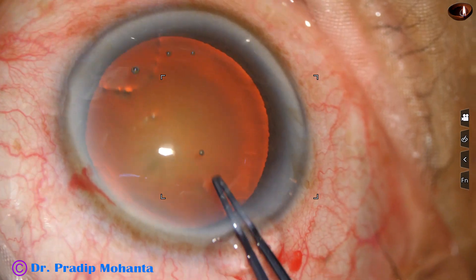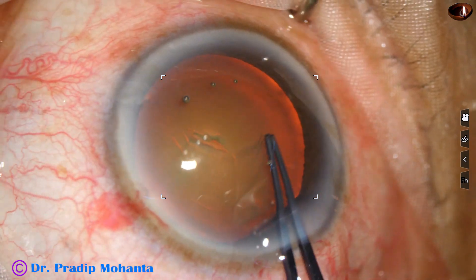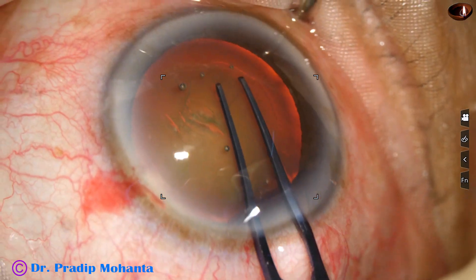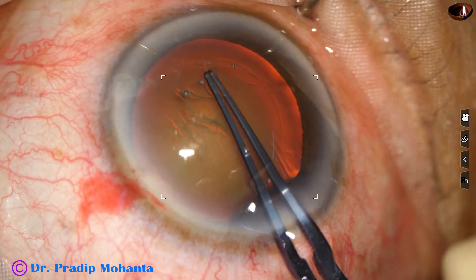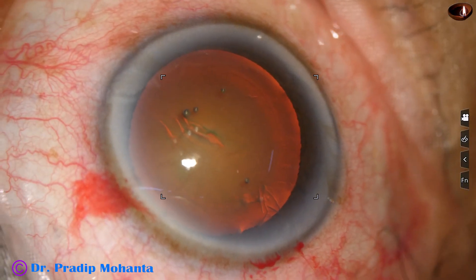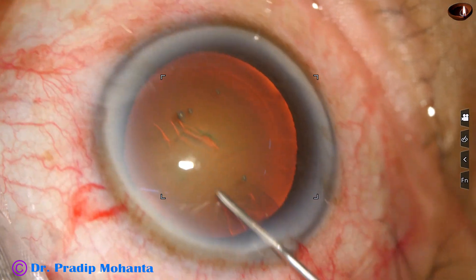Capsulorhexis is being done with the help of utratta forceps. There is a capsular tag. The tag is guided anticlockwise all around and an optimum size capsulorhexis of about 5.25 millimeters is achieved.